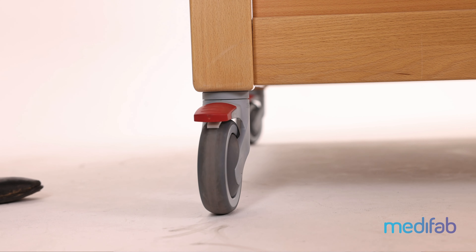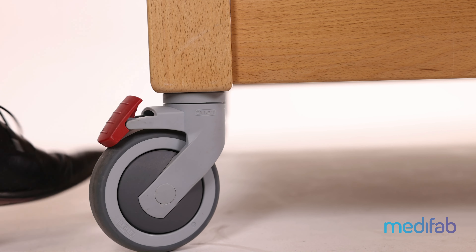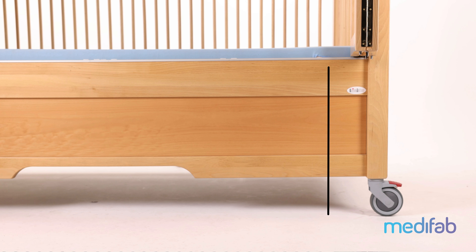Where a hoist is required, we recommend adding the casters to get enough clearance. The casters attach to the four corner posts on the bottom of the bed. This raises the bed up by another 16 and a half centimeters, which means that from the floor to the top of the mattress with casters it's approximately 70 centimeters.